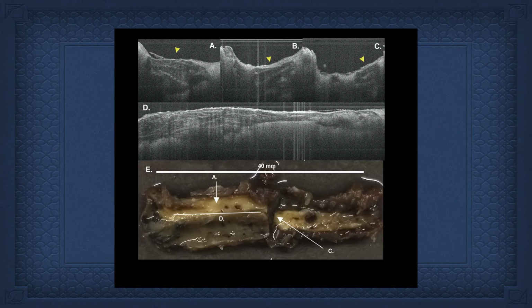So if we look at first an example plaque, the bottom is the pathology. The plaque is the artery's open, and the yellow is a long necrotic core, 40 millimeters long, that comes to the surface in intermittent points. It goes from the LAD, or the left main, all the way down the LAD.